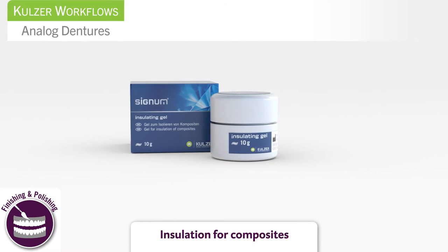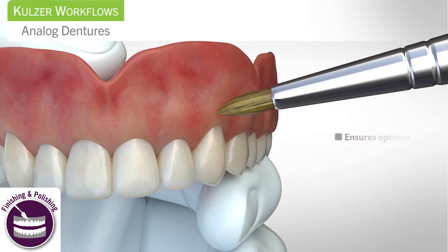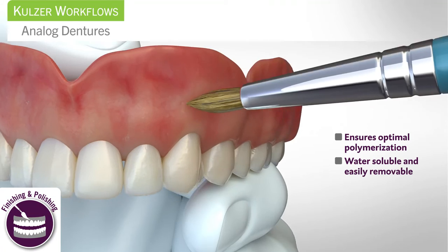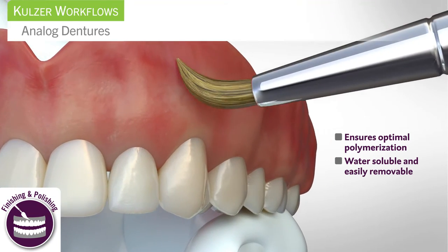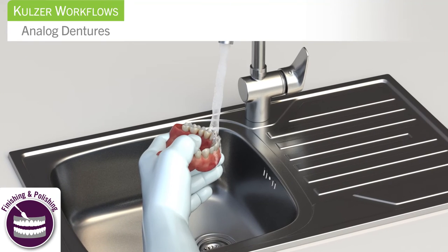Signum Insulating Gel is water soluble and provides insulation for composites. To ensure optimal polymerization and prevent the formation of a dispersion layer, apply a layer of Signum Insulating Gel before the final polymerization, then remove the Insulating Gel.